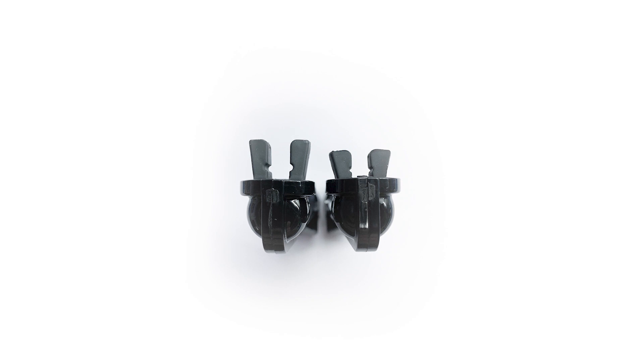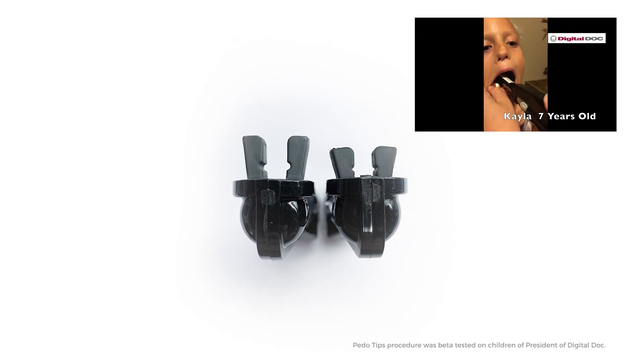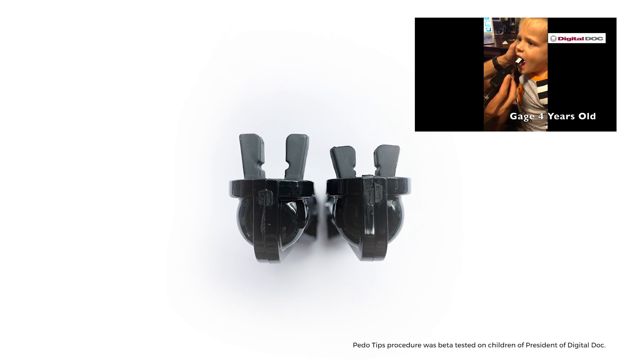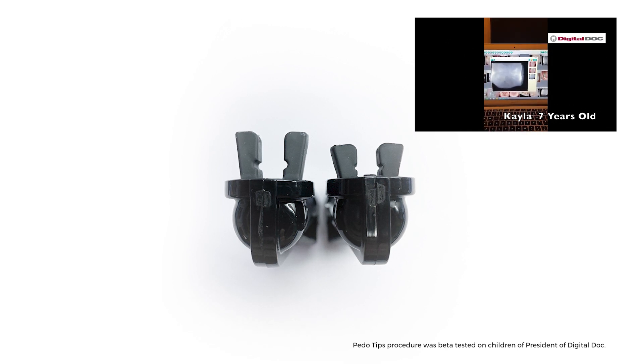We do have a pedo tip available. You'll notice in this photo that the pedo size is shorter. You can watch on our YouTube channel — there's an example of loom images taken with a boy and a girl, both seven years old. The boy can open his mouth really wide, the girl not so much. There's also a four-year-old boy we used the pedo tip on, and we were able to get access to all teeth with no challenges.